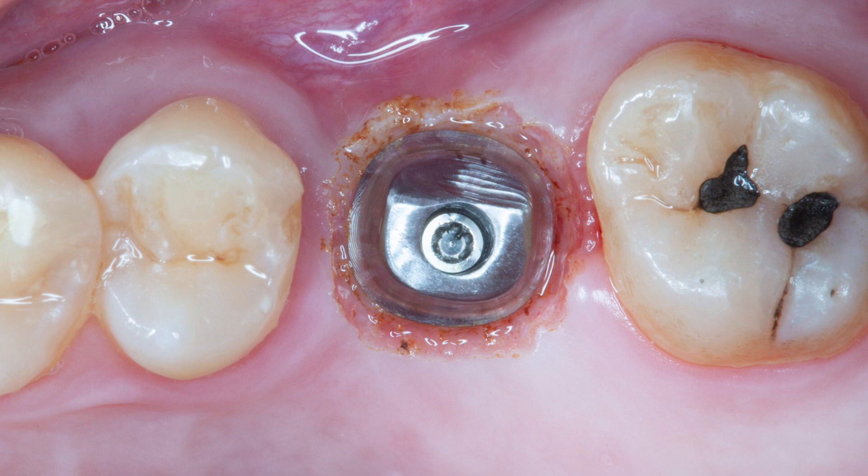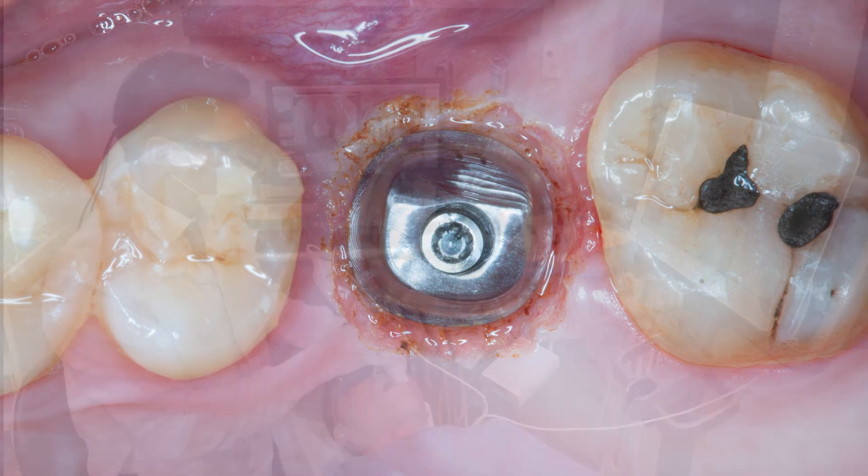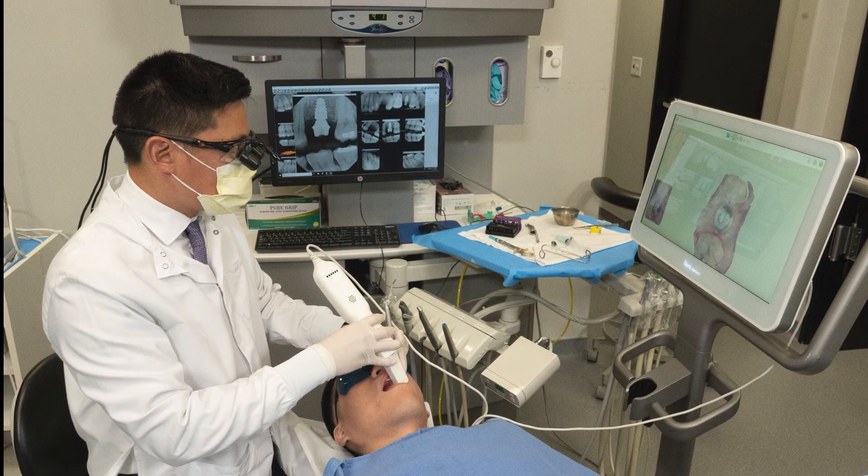Or if they're too deep, a screw retained crown or custom abutment like we have here is a much better option. Now that I'm done troughing around the abutment to expose the margins, I'll dry the area really well and isolate in preparation for the scan.